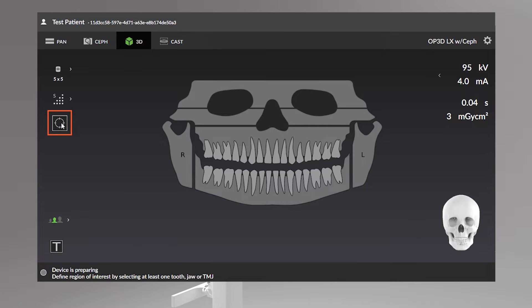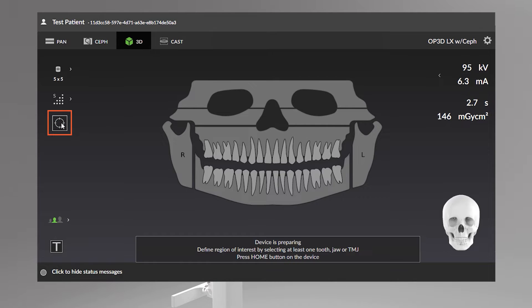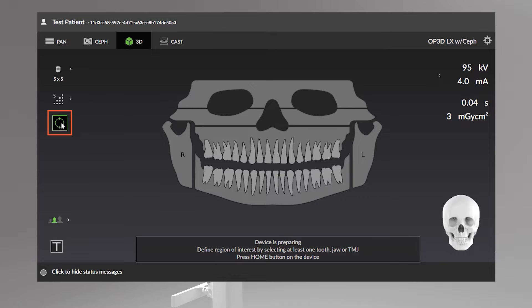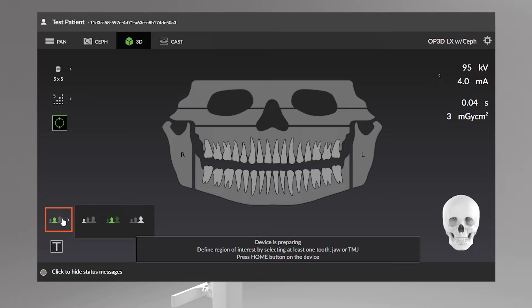This icon allows you to select the scout image program. A scout image is taken to verify and perform adjustments to the field of view position and height before initiating a full 3D scan. By default, the scout image option is always active when taking 3D images.